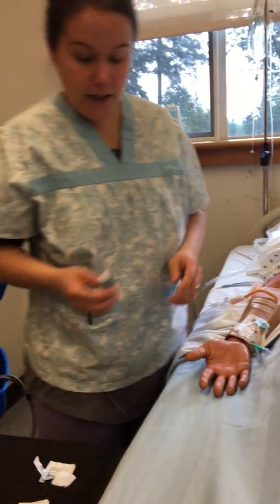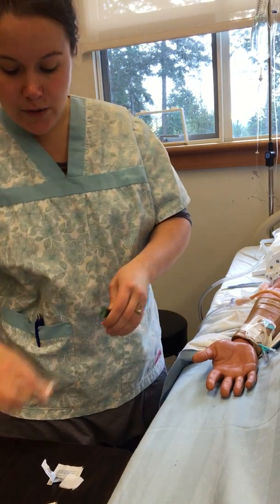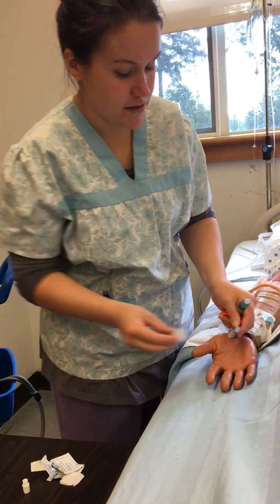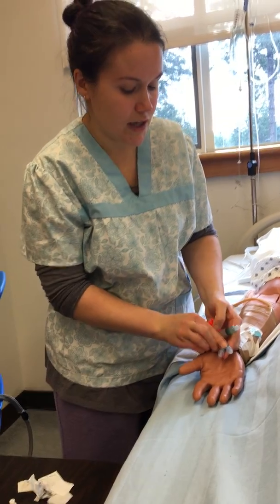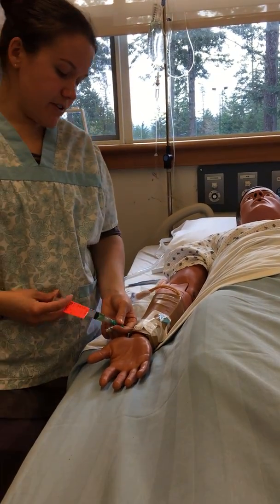Now I can give the medication. Now my IV monograph said to give 2 milligrams and 2 milliliters over 1 minute. So as I give her this medication, I need to clean this port again for 15 seconds and then use a no-touch technique as I connect and push this like ever so slowly.